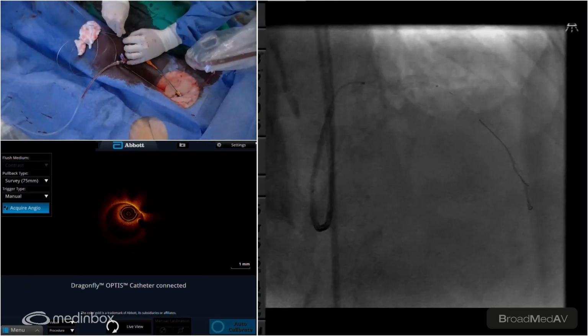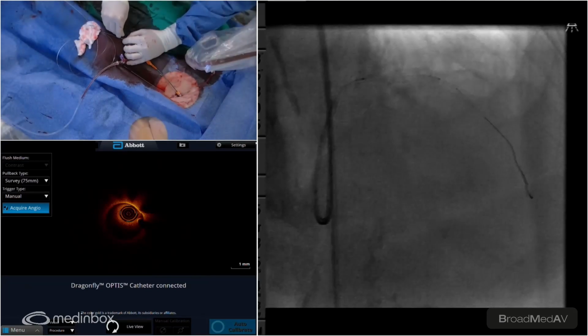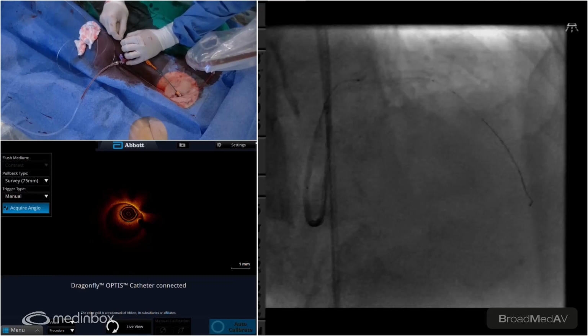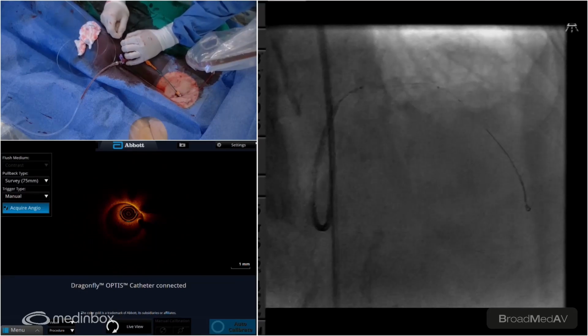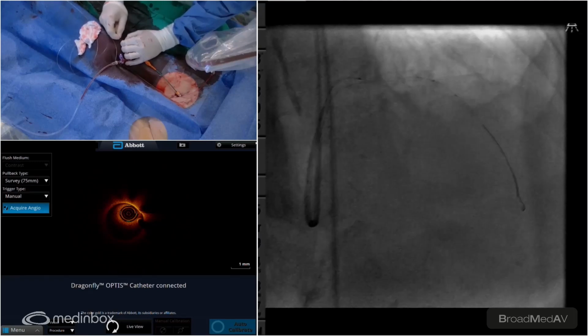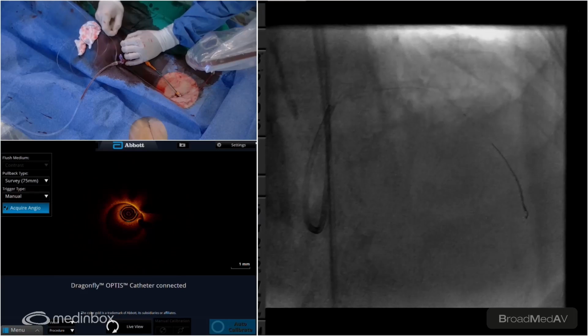Well, you buy yourself more support now with a deeper wire. I think he's just getting stuck on the angle. Might have enough to image that first nodule close to. Let's get a 6 French guide liner, please. Yeah, let's get a 6 French.